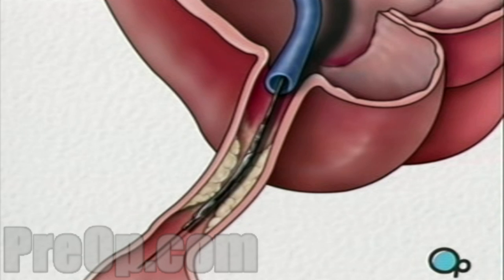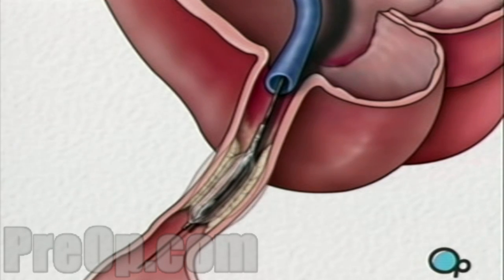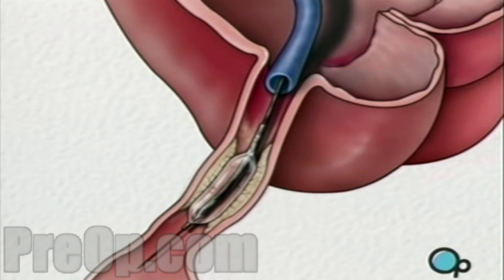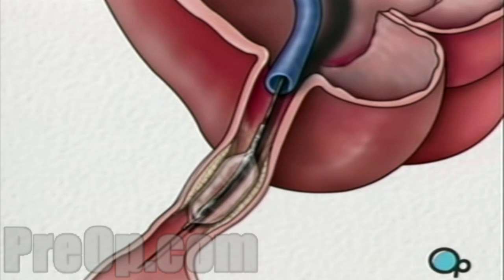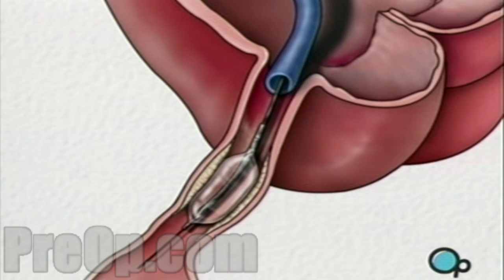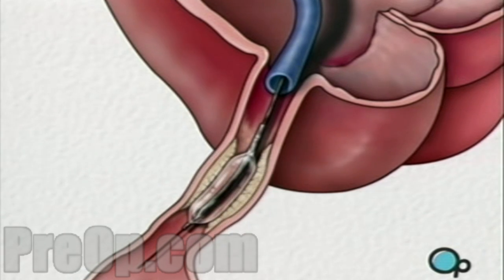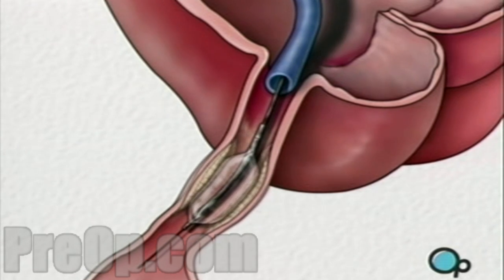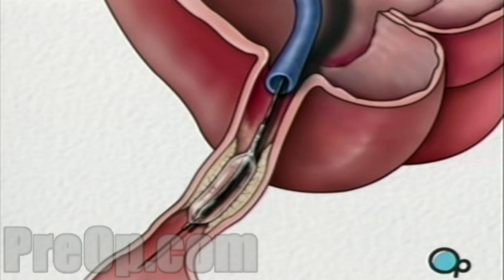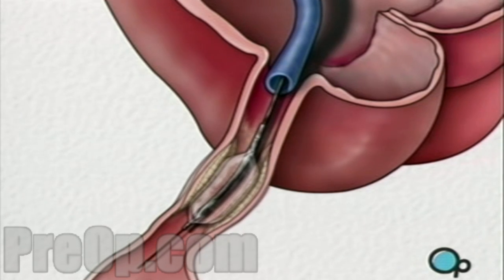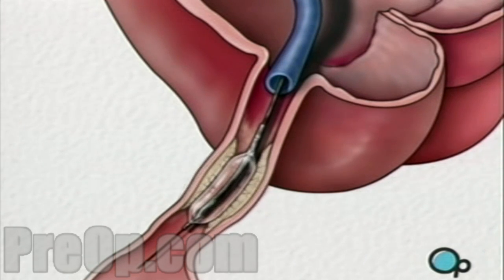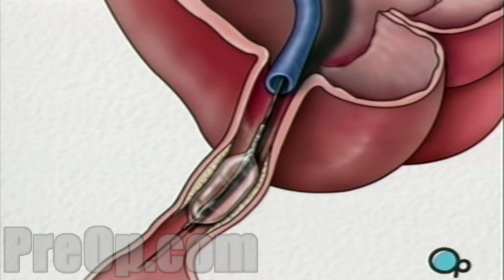The balloon is briefly inflated. As it expands, it squeezes the plaque deposits against the wall of the artery. It also stretches the artery wall and enlarges the channel through which blood flows. Your doctor will continue to inflate and deflate the balloon until normal blood flow has been restored.